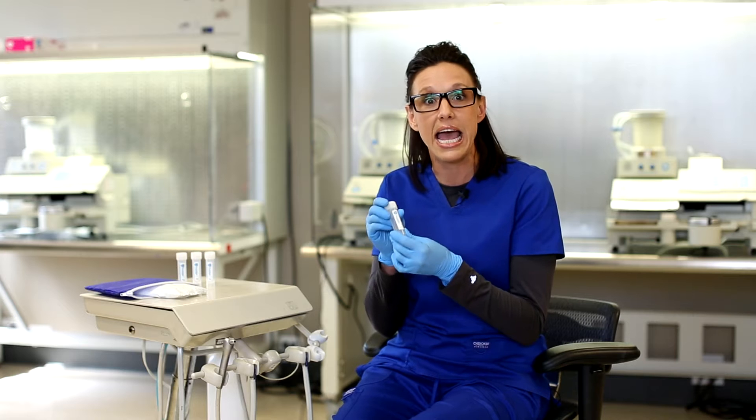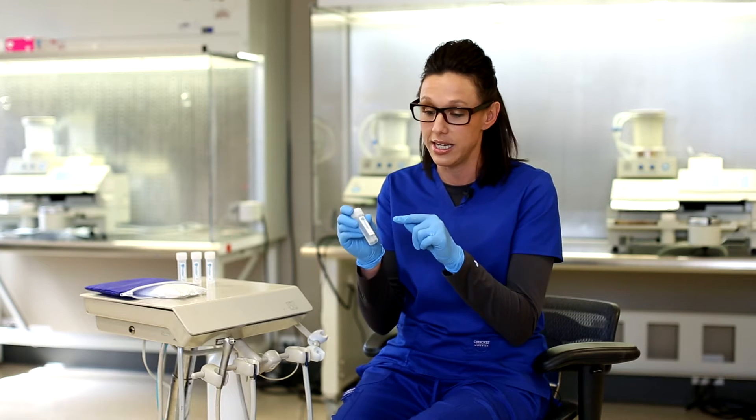Hey water safety team, today we're in our lab to give you a quick video on pooled samples. Pooling, or combining a sample, is a process of testing every water line from one unit in the same sample.